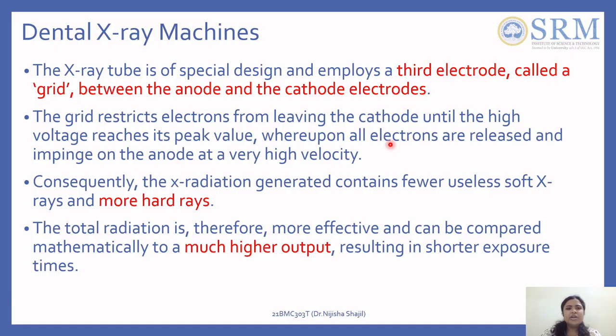At the first second, you have the electrons being produced, 1, 2, 3, like that. It becomes thousands and 10,000 millions like that. So with gradual electrons, when they collide, the X-rays that are generated also gradually increase. To avoid all this, we use a grid electrode which will catch all the electrons and wait, and then throw everything together to the anode. So in a very short duration, you have the required amount of X-rays produced.